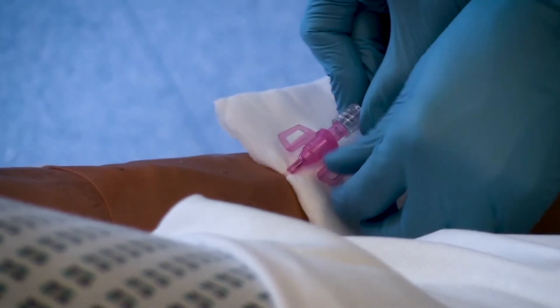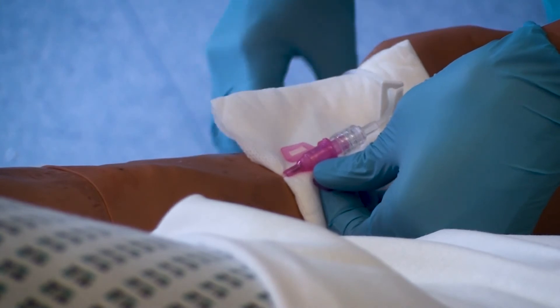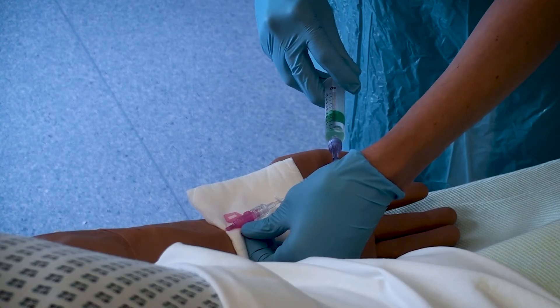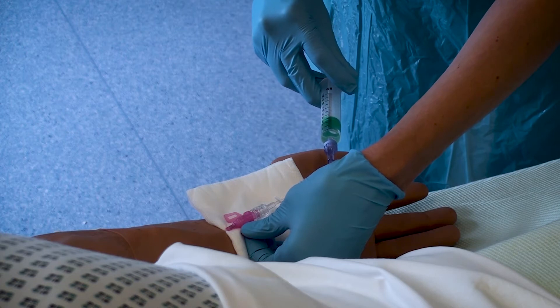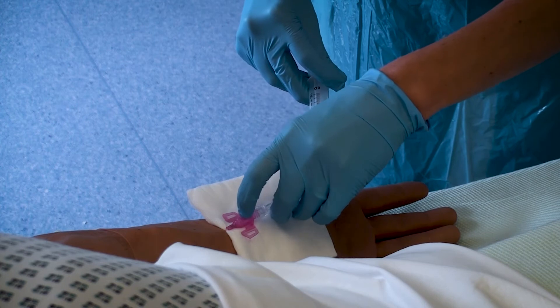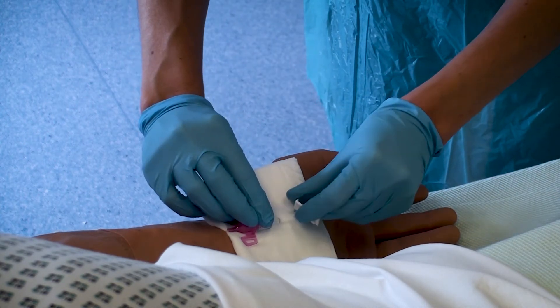Attach the appropriate connection device or extension set if you are not taking blood samples at this point. Flush the cannula whilst holding and securing the cannula in place with your other hand. Remembering to clamp off the extension set, remove the syringe.